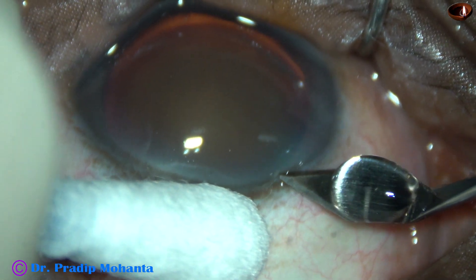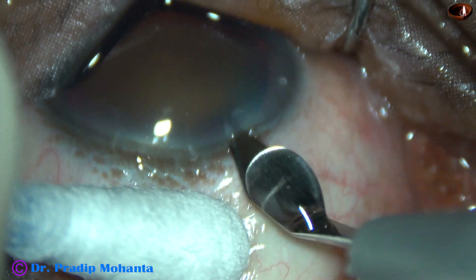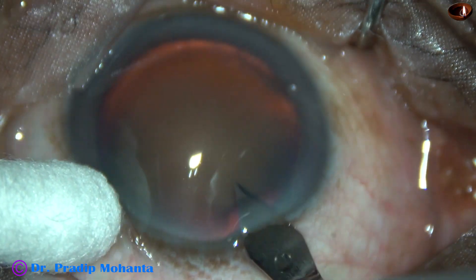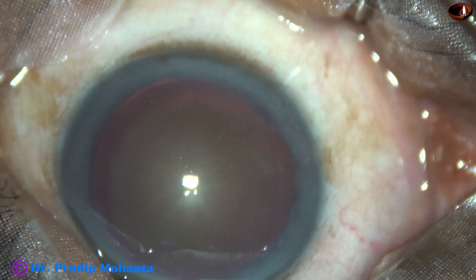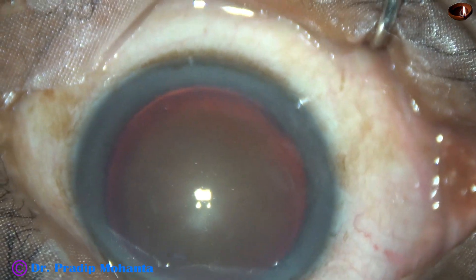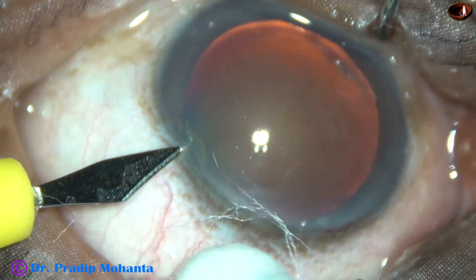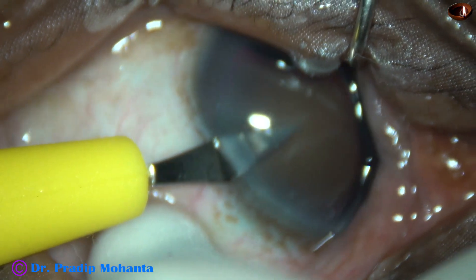This is the main incision with a 2.8 mm steel keratome at around 11 o'clock. A side port is made on the left side of the main incision, about 3 clock hours away, at around 2 o'clock.